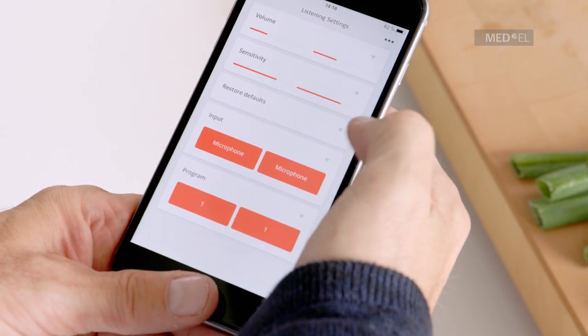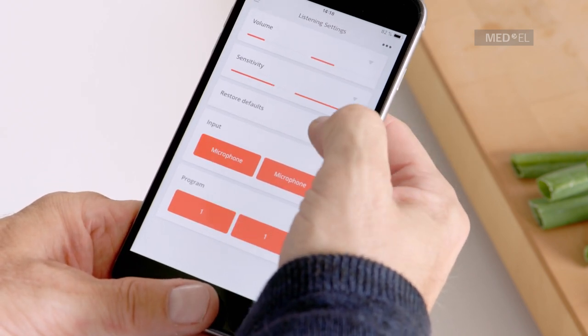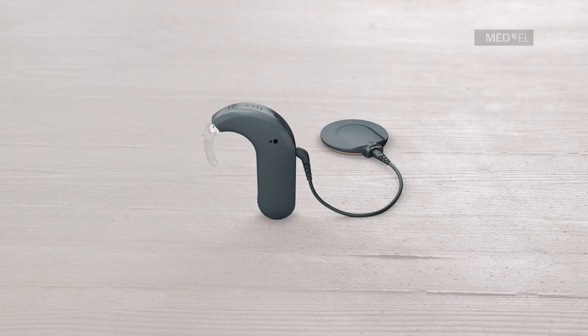Each time you change a setting, the indicator light on your audio processor will blink to show the command has been received.